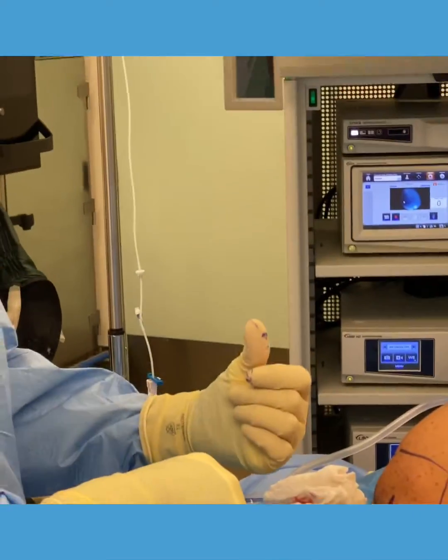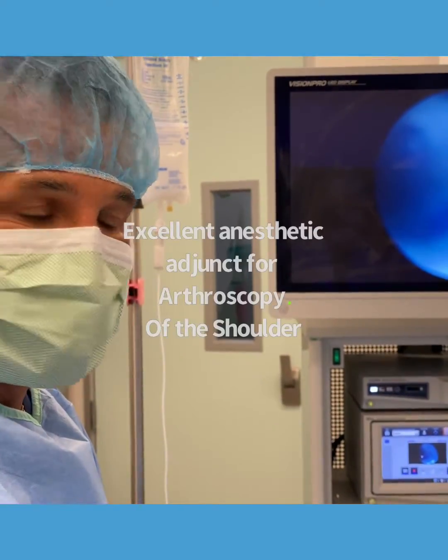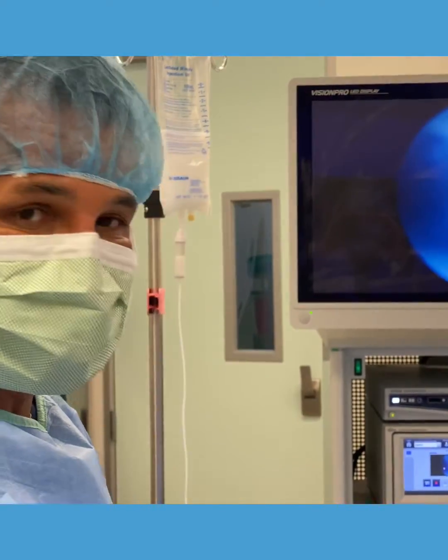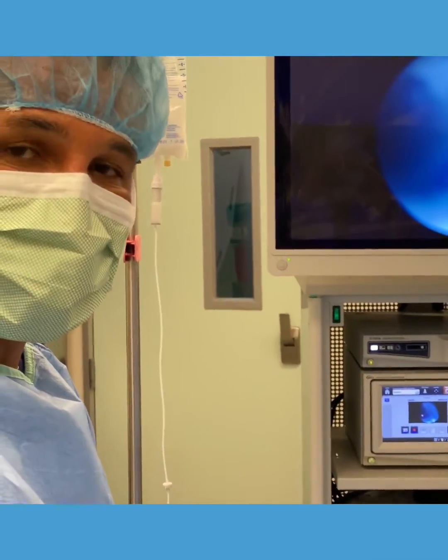I do this, as well as have my anesthesiologist provide a brachial plexus block, and that provides great pain control for these patients so that when they wake up they're nice and comfortable. Suprascapular nerve block — I'll post the reference for it. This is Dr. Moore showing you the suprascapular nerve block done just before entry into the shoulder.